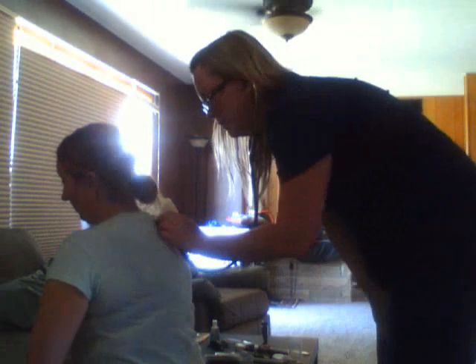Now I am going to listen to her posterior and lateral chest wall. All right, I'll have you take deep breaths.